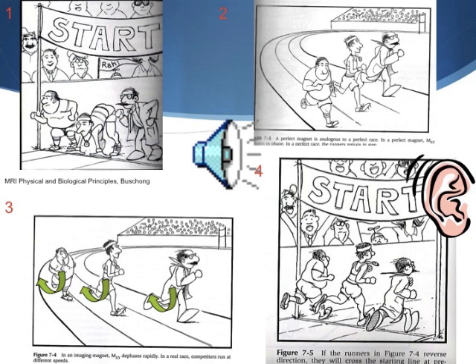When you as a technologist select the parameter called echo time on your pulse sequence, you are telling the computer when to listen to the echo, when to acquire that signal from the protons. And depending on what that time is, the protons are going to be in phase with each other, out of phase with each other, have the most signal, have less signal. And all of these decisions will determine what the image will look like when it appears on your screen.